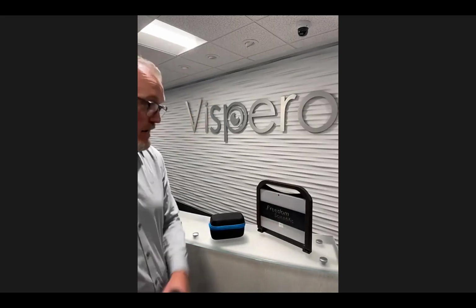Someone asked, is it just ZoomText, or could you also run Fusion on that? I have Fusion on this, actually. I was running it with a Braille display just to test that environment, and running ZoomText, obviously, in parallel with that for the integration with the Onyx Pro. So the answer to that is very much yes.